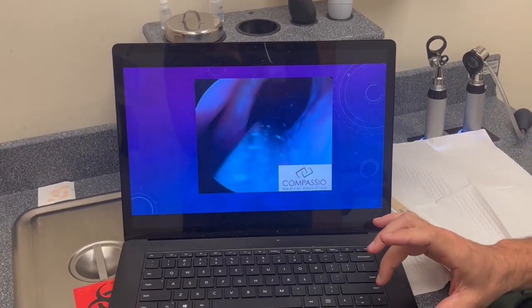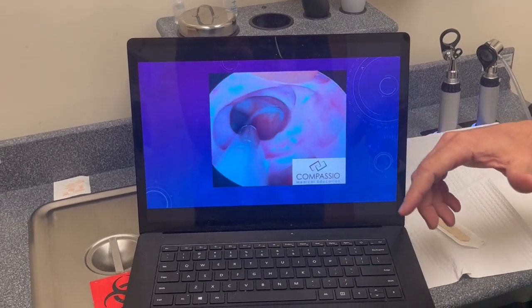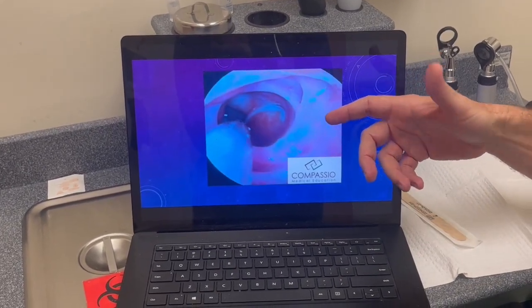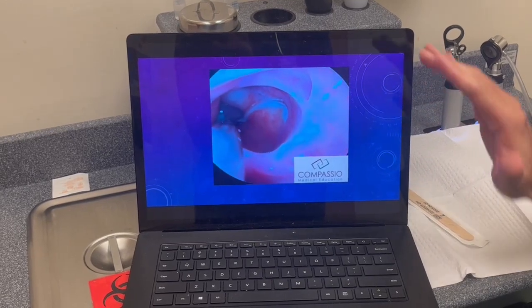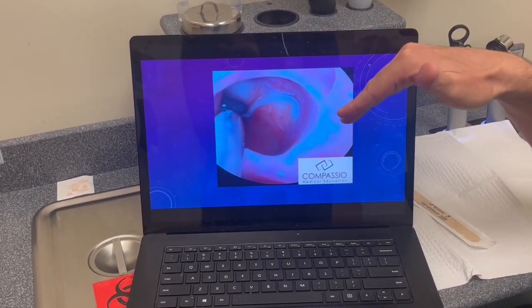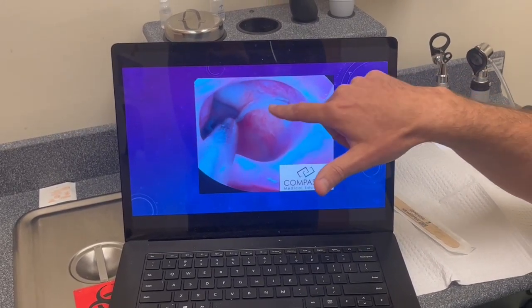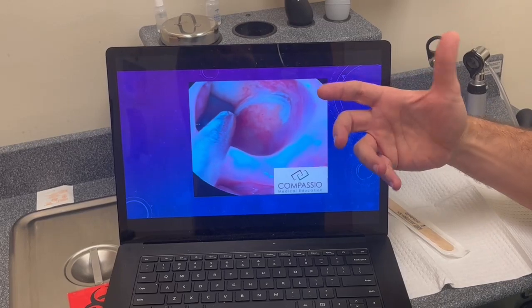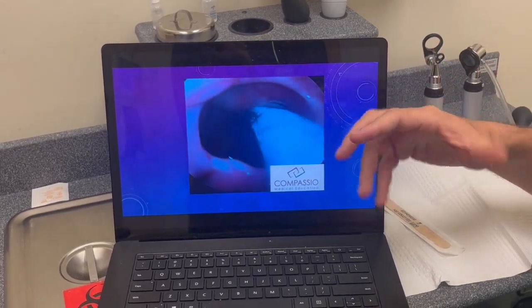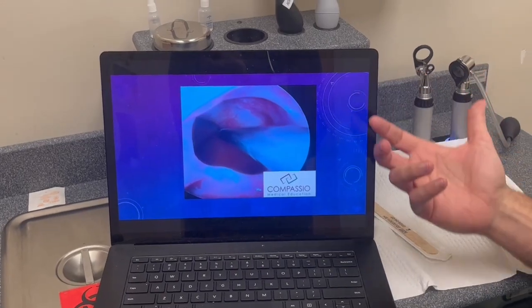The nice thing about when a patient has sinus surgery is now I can go in with a suction and actually suction out that mucosa, or that infection. Here I am going over a ledge with a curved suction and aiming down towards the floor of that sphenoid sinus. I'm able to get that out, as well as this little streak of mucus. After this, I have the option of putting antibiotics directly into that sinus instead of putting the patient on an oral antibiotic.